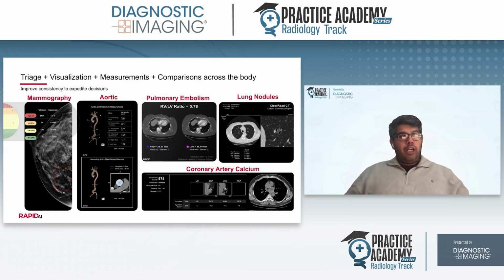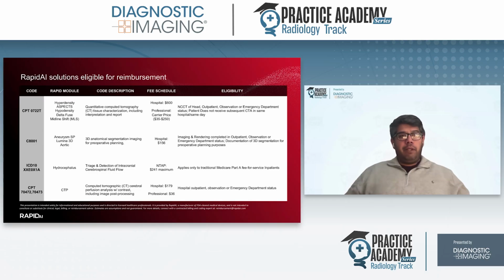Deep Clinical Eye not only provides a clinical benefit, but also allows for increased eligibility for incremental reimbursement. For the most part, triage AI tools do not qualify for reimbursement codes, but those that quantify or generate reconstructions can be eligible. So there are a few different ones that we utilize.